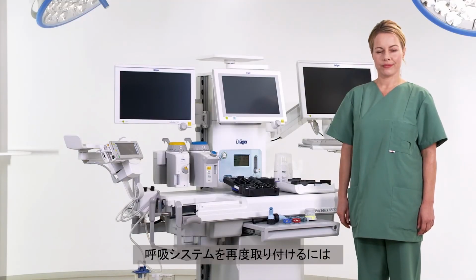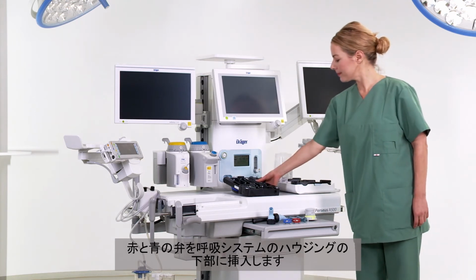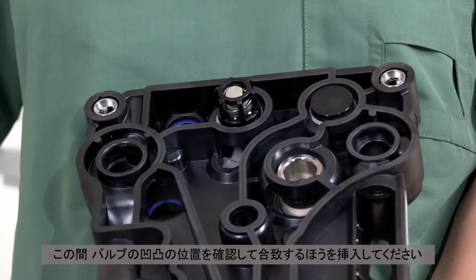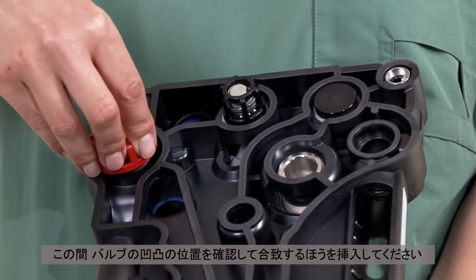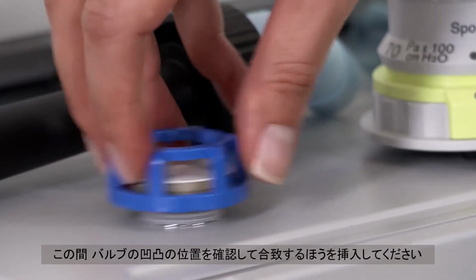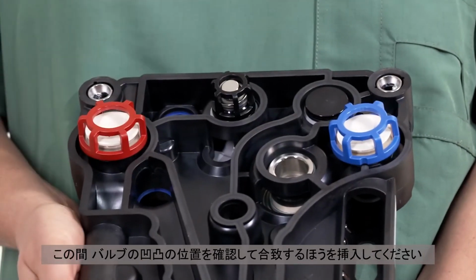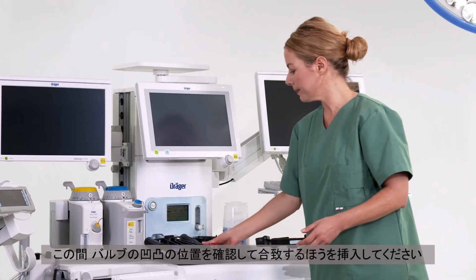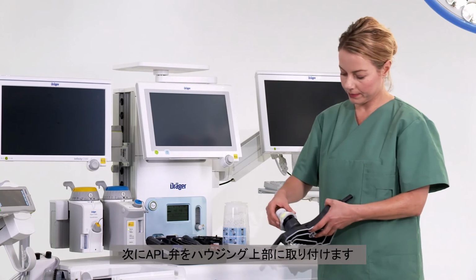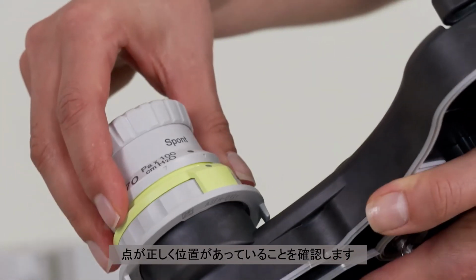To reassemble the breathing system, insert the red and blue valve into the lower part of the housing of the breathing system. Observe the mechanical coding of the valves when doing this. Now attach the APL valve to the upper part of the housing. Make sure that the dot is correctly positioned.